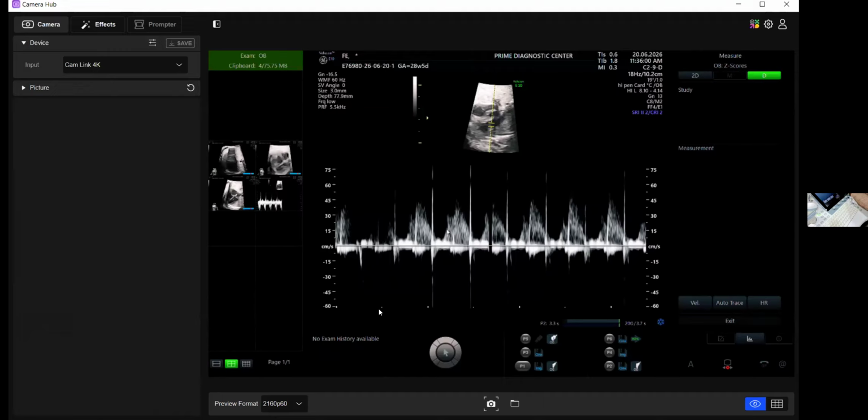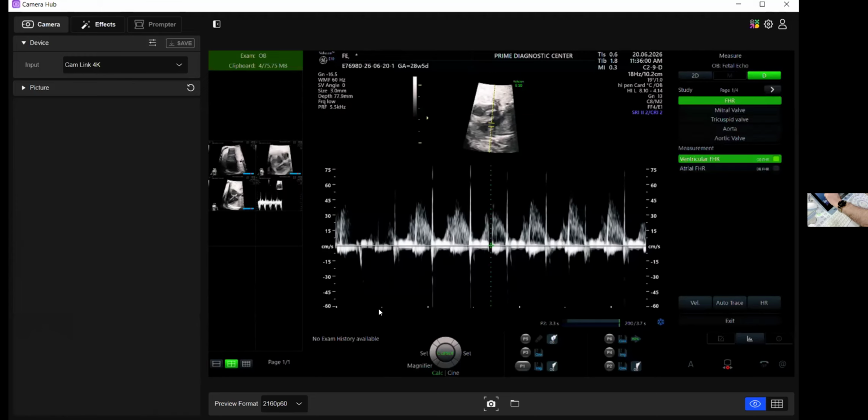Where do we go? Z-scores. Okay, stop. Then we go to calculations. We go to Z-score. What? Clear study. Fetal echo. Oh, okay, we didn't want to do the Z-scores.